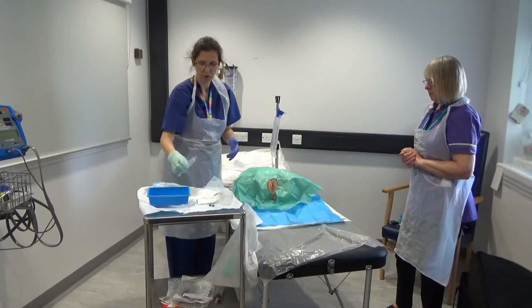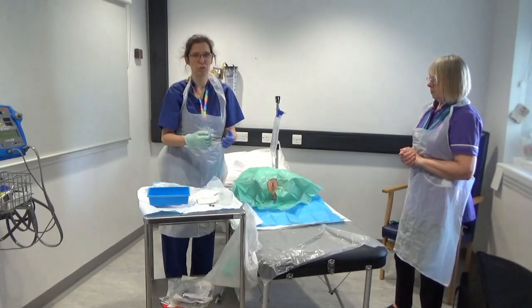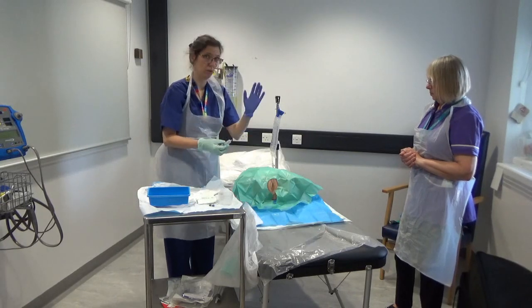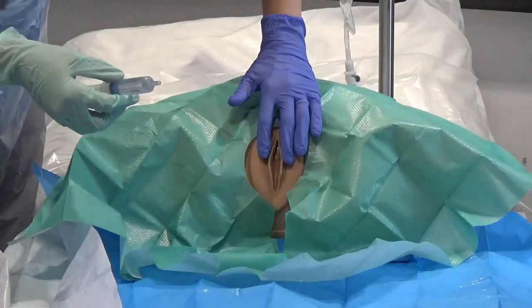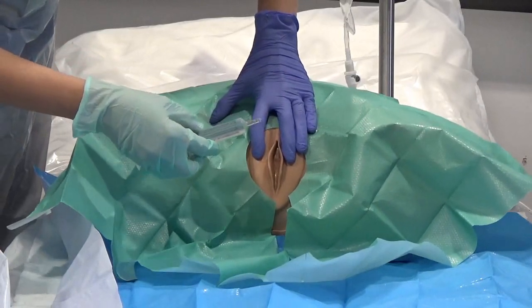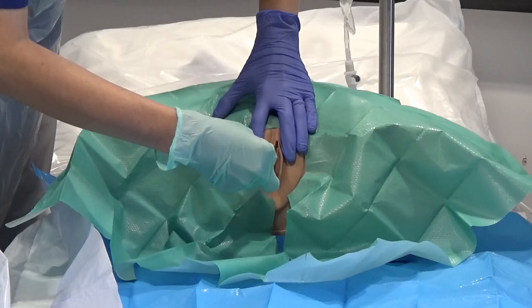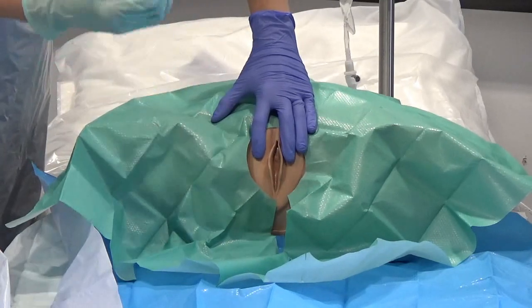The next step is to use the local anaesthetic gel. A female urethra is only about three centimetres long, so you don't really need to inject a lot of gel, but the area around it can be quite sensitive so do use a good amount. I'm going to use my dirty hand to touch the patient — checking with the patient that she's all right — gently spreading the labia majora and then just putting a tiny bit of gel around the external meatus and, when you can see it, also a little bit inside. I haven't used much here because it's a model and it blocks the view of the catheter, but feel free to use the whole syringe. Then gently let go.